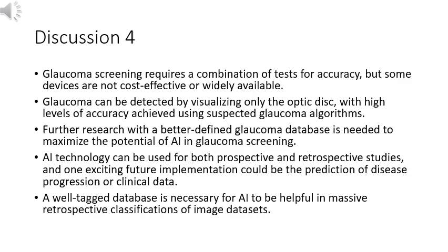Screening for glaucoma is much more complicated than doing so for other ophthalmological diseases. Authors have had the best outcomes with a combination of the slit lamp, OCT retinal nerve fiber layer, RNFL, and visual field tests, but this combination is not the modality of choice when we want to consider devices that are low cost, widely available, and easy to use.